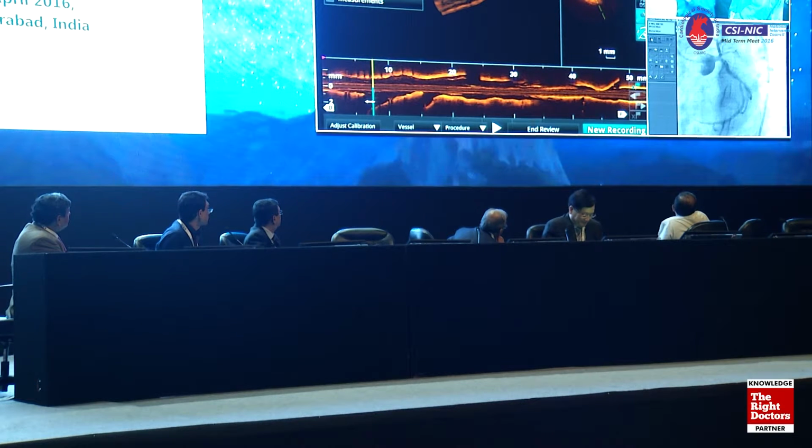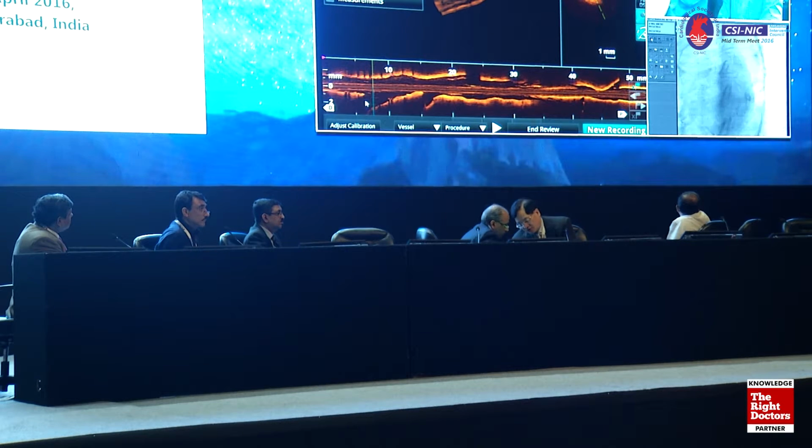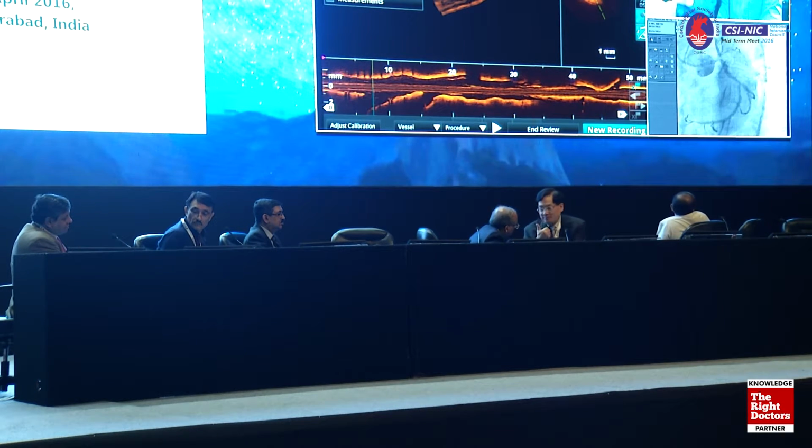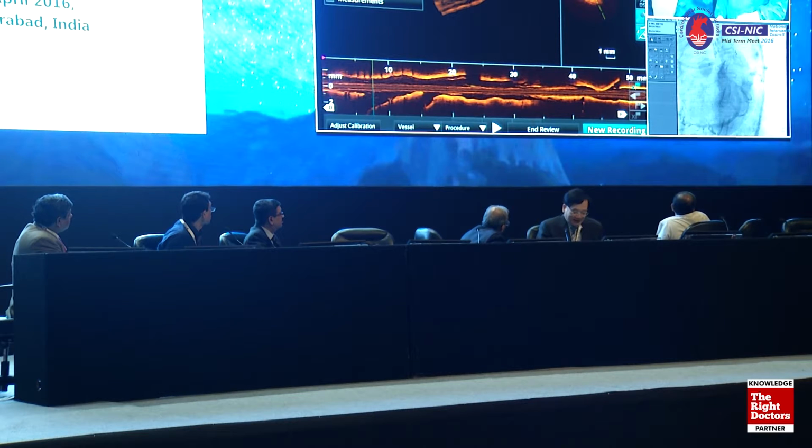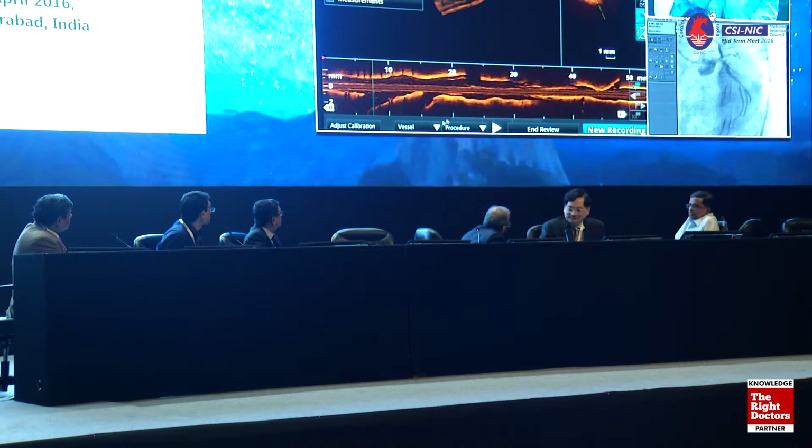In the past, we used to go back and dilate. Doesn't matter, though you're small, as long as your stent is fully expanded, there's no gap. Your little bit of small plaque protrusion is a normal phenomenon of PCI, and as long as you have good angiographic results, most of the time with that small plaque protrusion, we do not go after it.